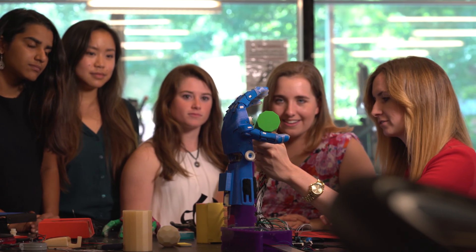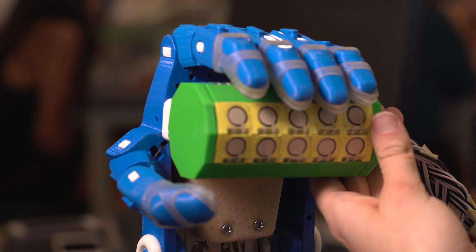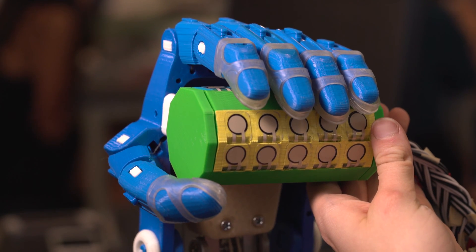We're Carpel Diem. We are a team of two mechanical engineers, two bioengineers, and an electrical engineer. What we're working on is creating a force testing device, or suite of different devices, in order to test 3D printed prosthetic hands.